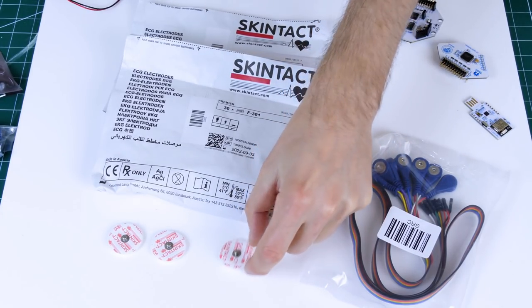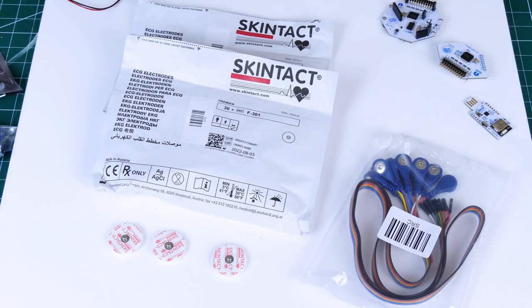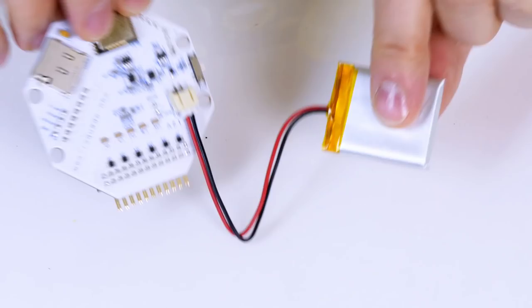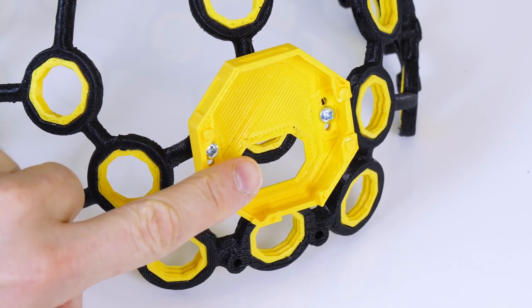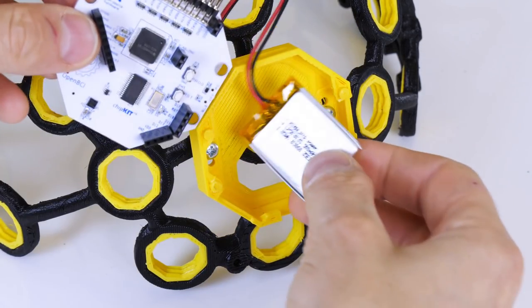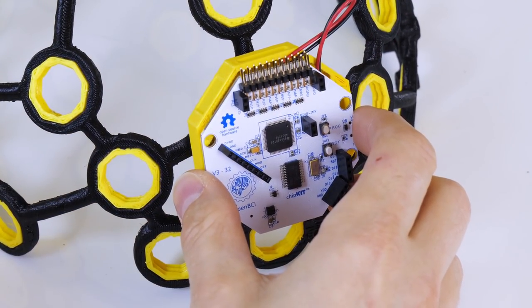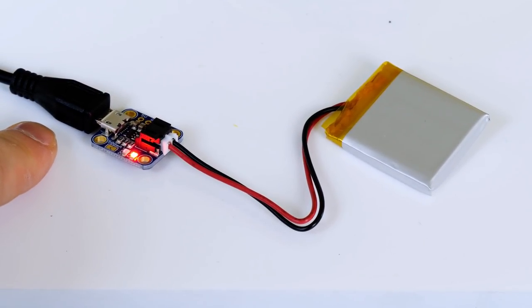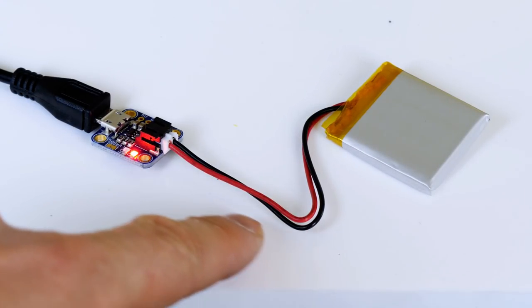The kit also comes with eight snap-on electrodes suitable for adhesive skin-tacked electrodes — you get a couple of bags of those as well. Those stick directly on your skin and could be used for muscle sensing if you want to build an exosuit or something like that. OpenBCI recommend using a single-cell LiPo which fits in the back of the board. I've got an Adafruit charger for a single-cell LiPo that charges via micro USB.